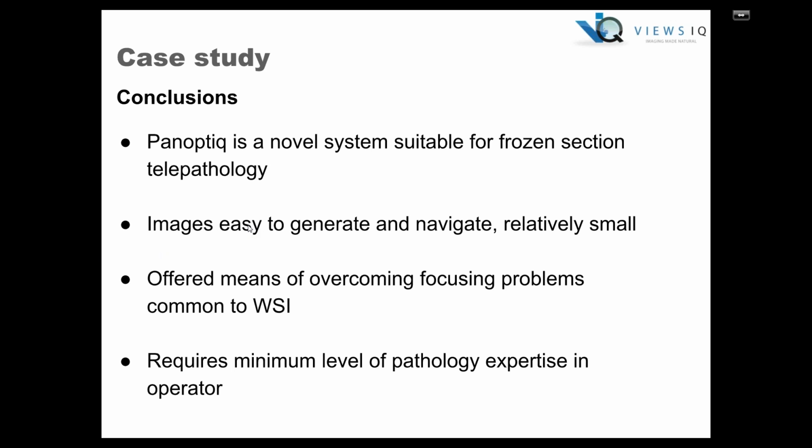Now, the conclusions of this study were that Panoptic is a new system that is suitable for frozen section telepathology. Panoptic images are easy to generate and navigate, and they're small compared to whole slide images. The system also provides a means of overcoming some of the focusing problems common to whole slide imaging, such as thicker or uneven tissue sections, folds, or bubbles.